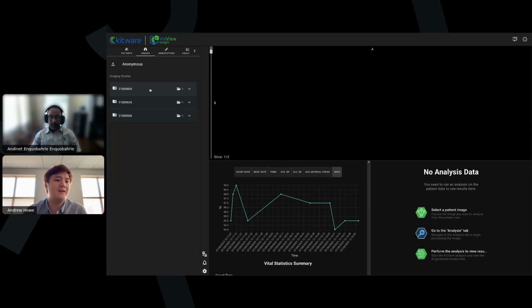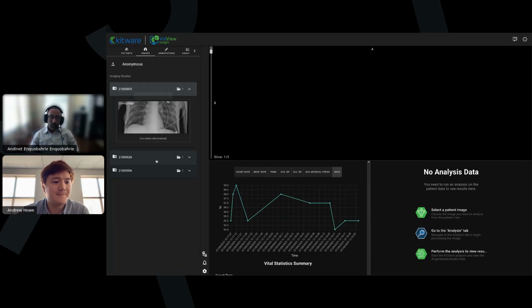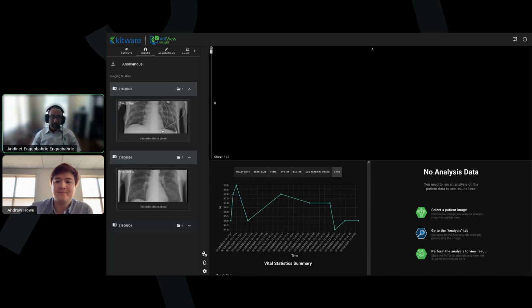Yes. So there is a way that you can identify a patient through a tag in the DICOM data, as well as there is an identifier for the patient resource. And when the connection is made between the two different data sources, the IDs must be unique. But once that matching is made, you're basically now focused on a single patient through the patient ID. Just to chime in on that, yes, that's set up in the configuration we have.